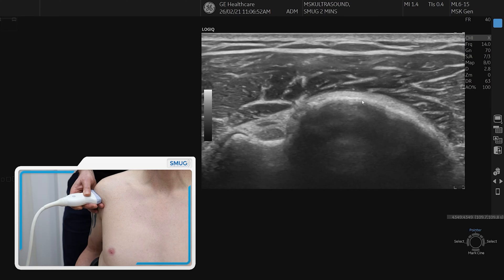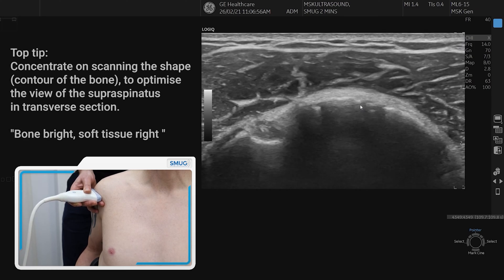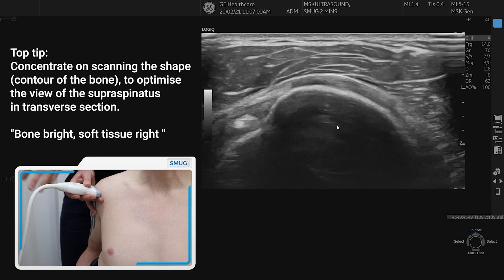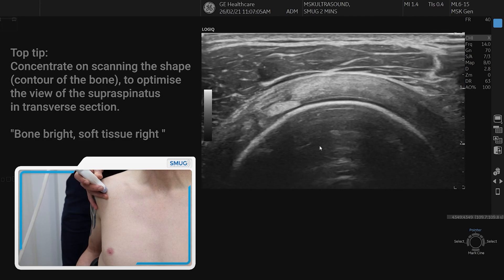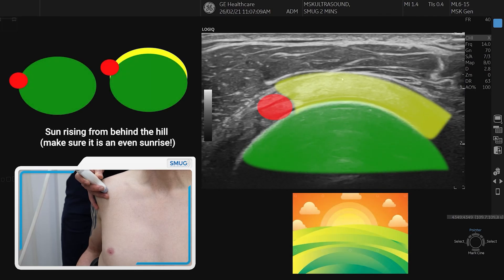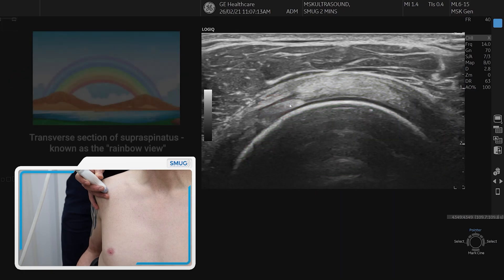Carefully scanning the shape of the bone and ensuring that the bone is kept nice and bright, we bring the probe up and over to visualise the supraspinatus in transverse section, trying to keep the bone bright and seeing a nice parallel band of tendon. Here we can see the supraspinatus in cross section with the long head of biceps to the left.